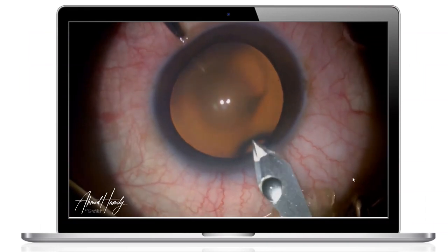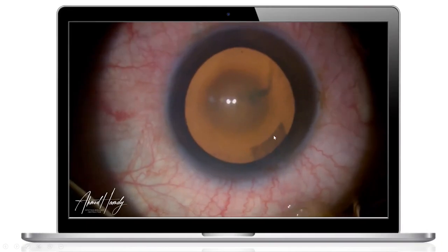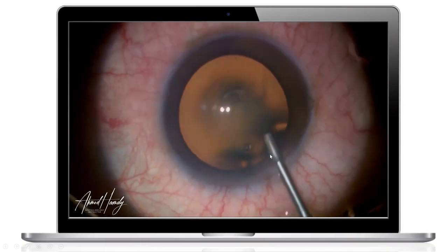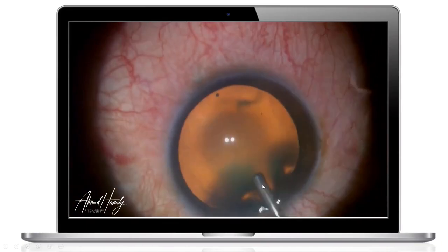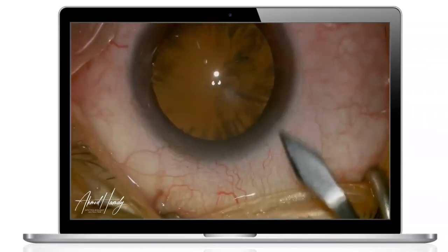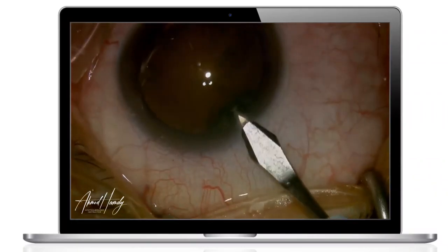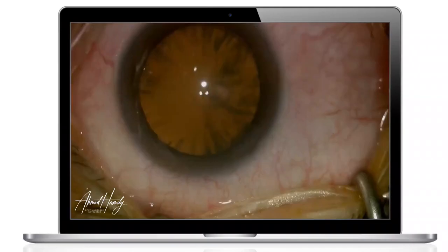Just making the incision at the necking of the blood vessels, the limbal blood vessels, making the incision width almost like the length. So making it also, there is what's called uniplanar or biplanar or multiplanar or triplanar, to make the wound self-sealing at the end of the surgery.